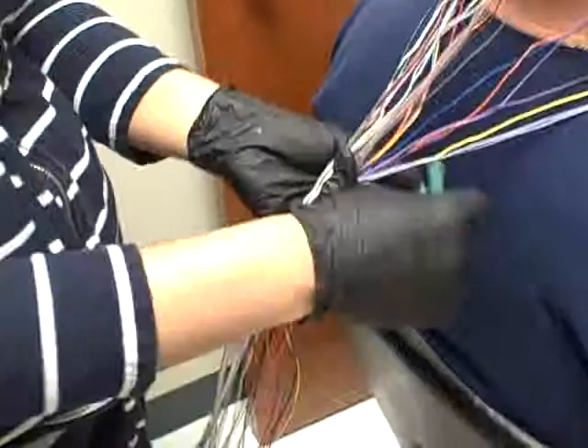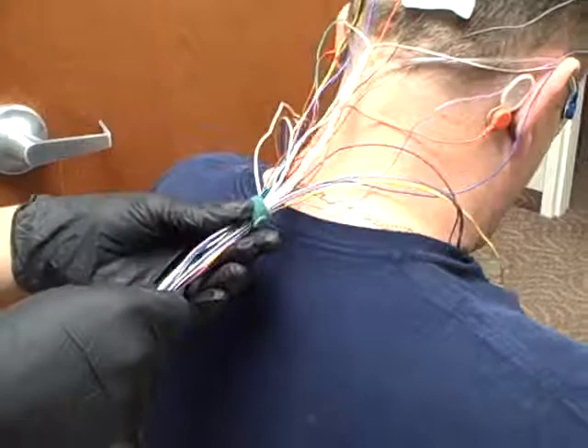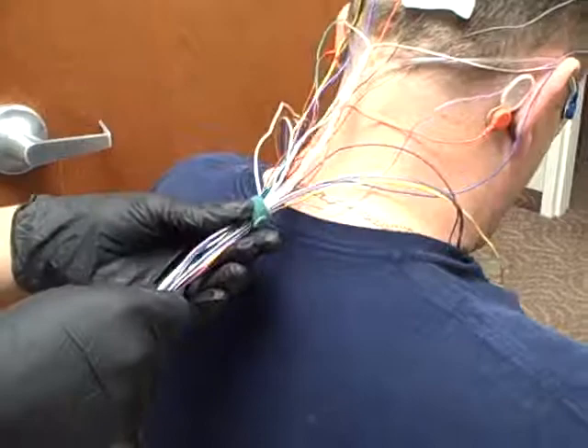That's it for the head box. Once the patient is completely wired and set up, you're going to bundle the wires to eliminate any slack. Ask the patient to put their chin to chest, and make sure you give enough slack so it's loose enough there. Then continue putting the cable ties on.